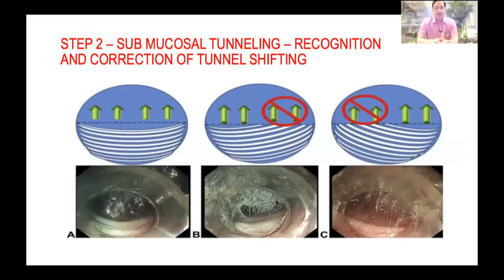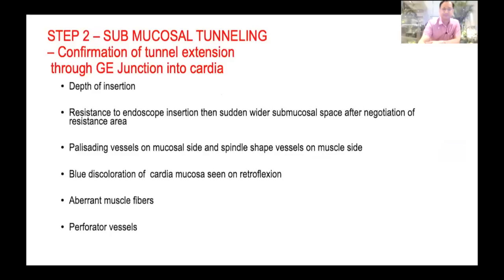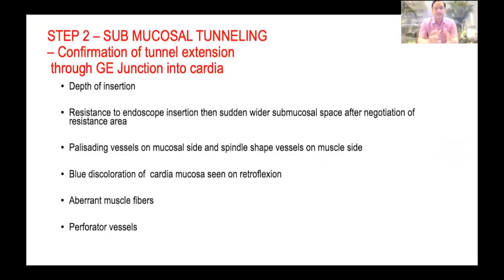Lateral dissection is much more important than central dissection — you should have adequate lateral dissection on both right and left sides. You can see tunnel more dissection on the right side, and here more on the left side; recognize this early and correct it. To identify that you have reached the GE junction: you can know by the depth of insertion, and by resistance while negotiating the scope into the tunnel because the lower esophageal sphincter is spastic in achalasia cardia. You start getting palisade vessels on the mucosal side and spindle-shaped vessels on the muscle side. You can also retroflect into the stomach and see the discoloration of the cardia, aberrant muscle fibers, and sometimes perforating vessels.